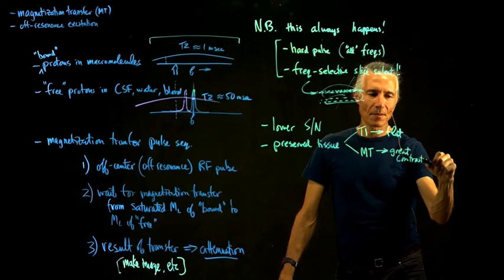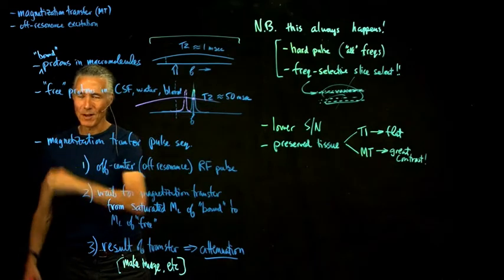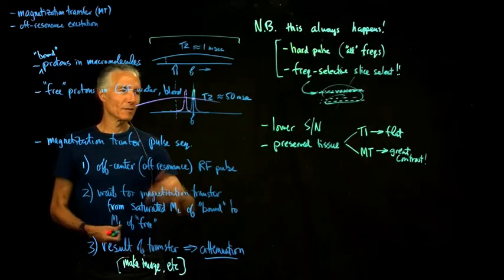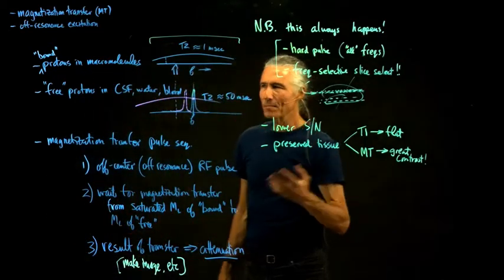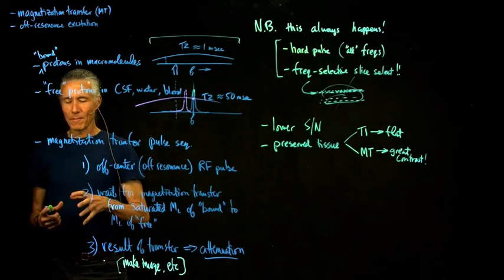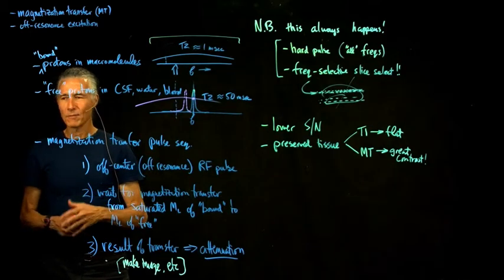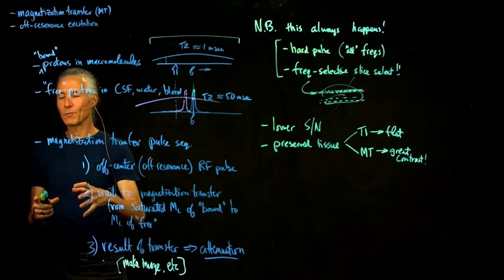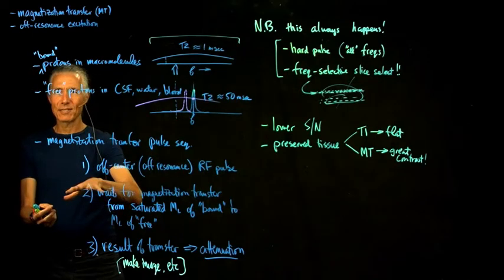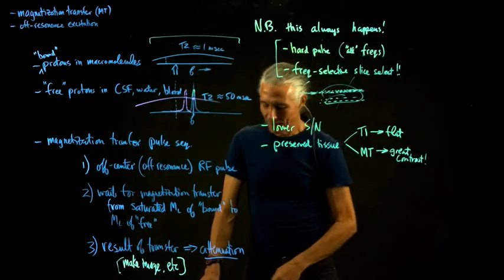One of the big advantages of a dead brain is that you can get higher signal to noise by scanning it for 12 hours. So you can easily increase your signal to noise. For preserved tissue, there's a lot of people starting to do this, where they take a whole brain, and rather than sectioning it up, just scan it overnight in order to look at the structure of it. There's a lot of advantages to that. It's a lot easier to just stick it in the scanner for 12 hours than it is to cut 8,000 sections through it and take each one off and stain it and do all the work of that. So there's a growing field of studying preserved brains.